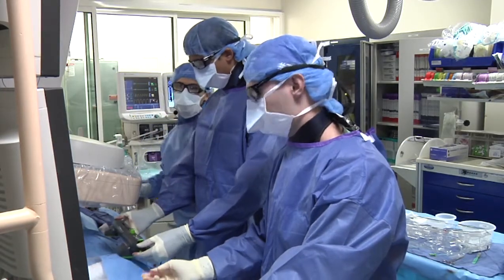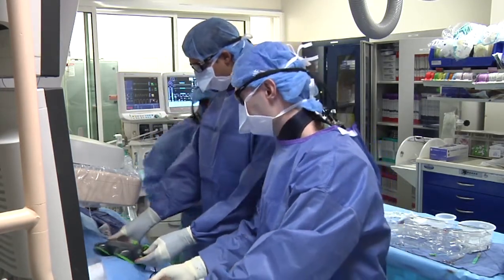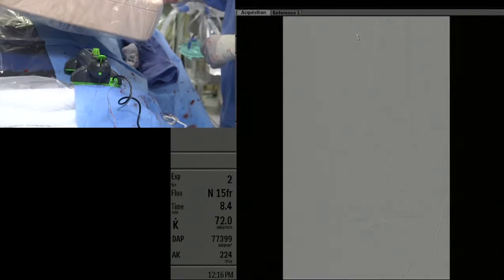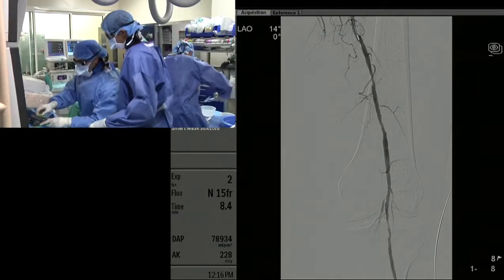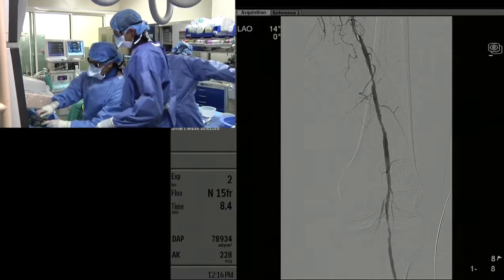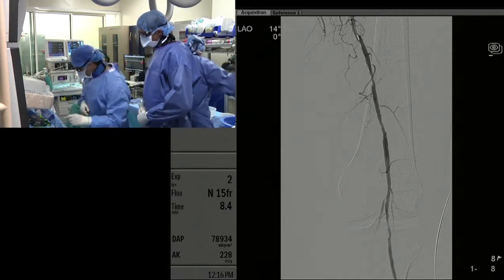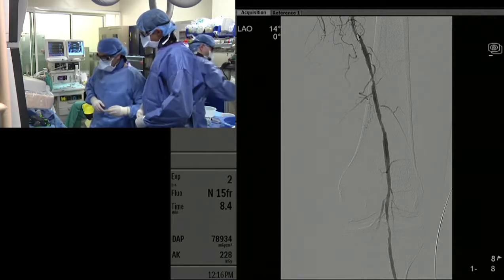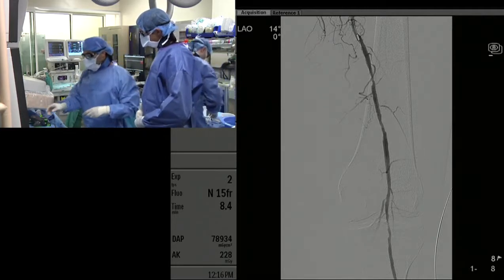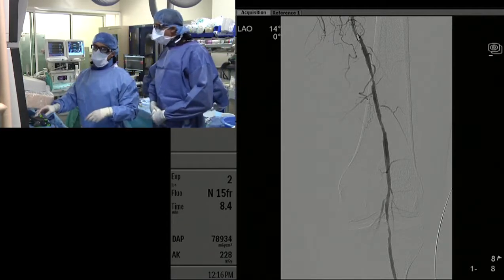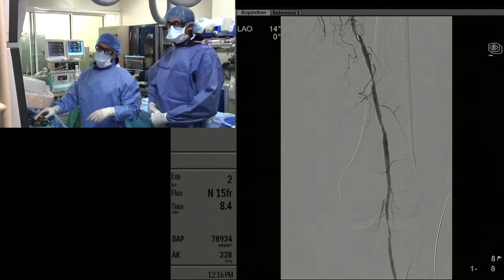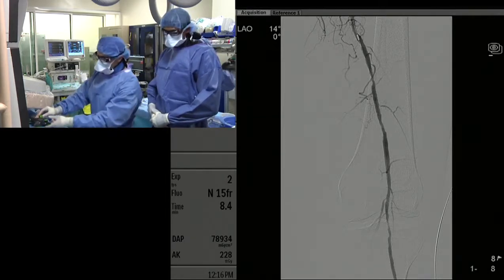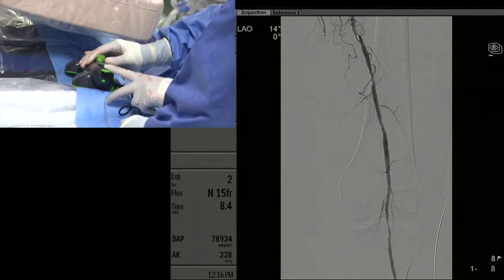Now we're seeing the CSI system, and we're set up to do the atherectomy. The CSI actually has three speeds: low, medium, and high. We're going to do this with low speed for now. The wire is locked here.